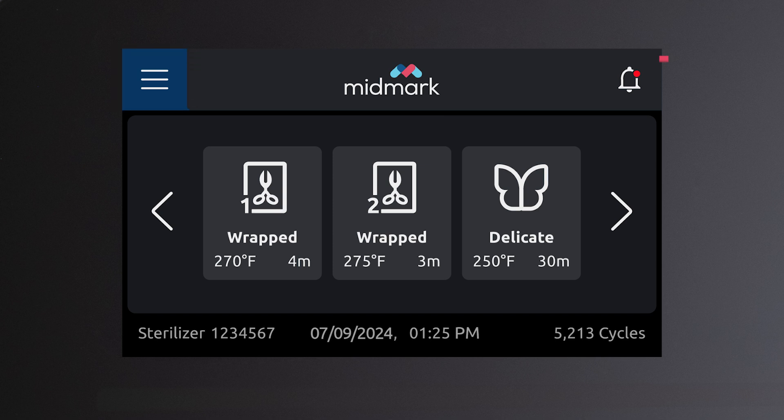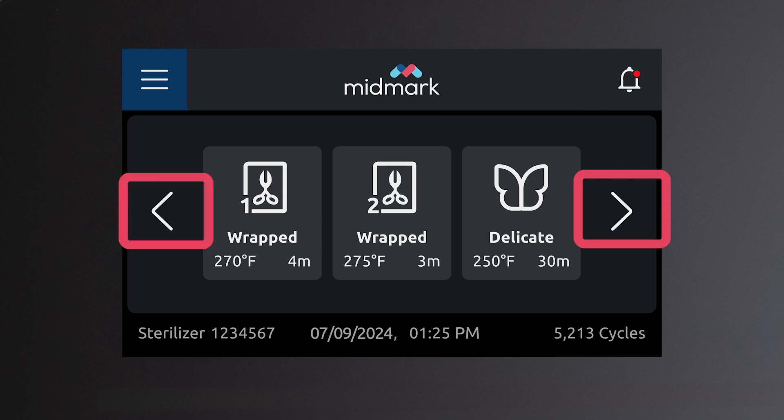The notification center icon is located in the top right corner of the screen. A red dot indicates you have an active notification. The left and right arrows allow you to scroll through the sterilizer cycles.